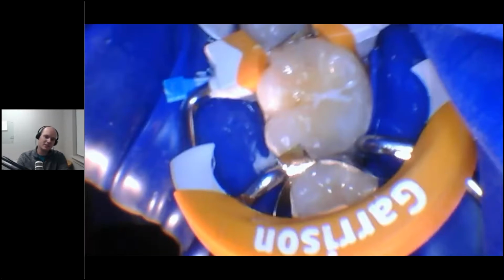Like I said, keep the original rings on. This was a case where I tried to get the short ring on and I couldn't, so I had to go back to the original ring. It just was not ideal. I'll show this case later.